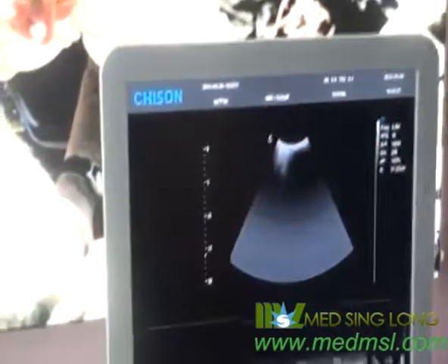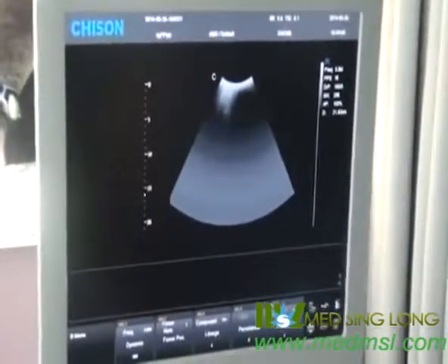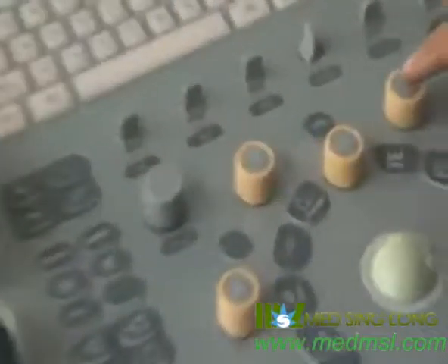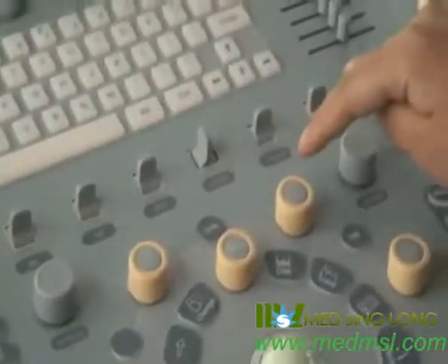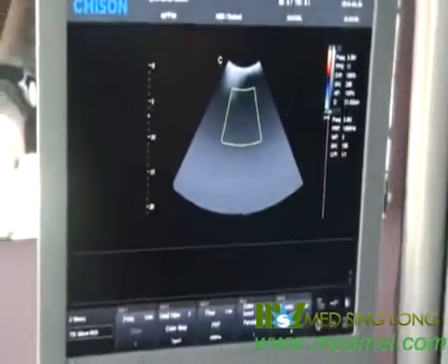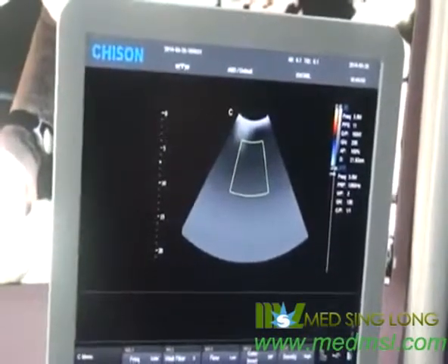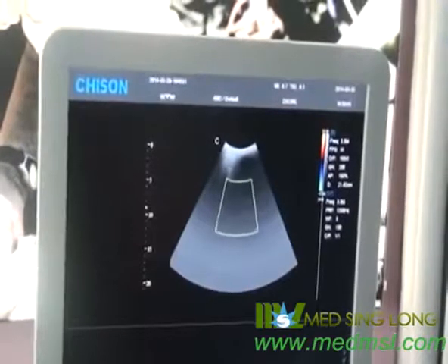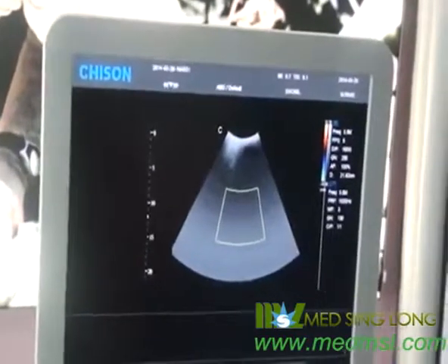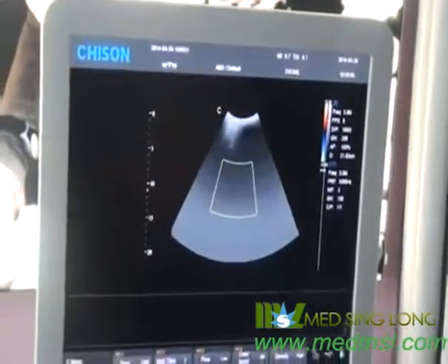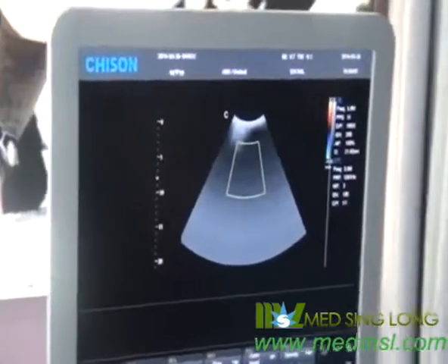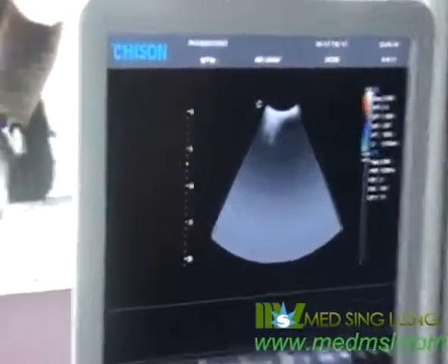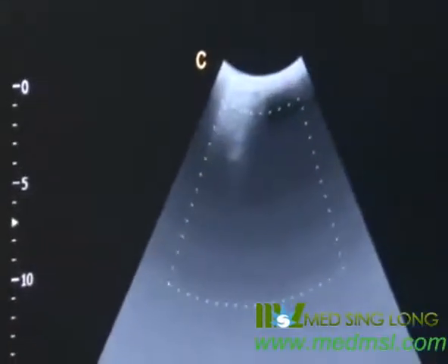Let's get into C mode. Just press the C knob and the color sample box will appear. We can move the trackball to change the position. Press the Enter key and move the trackball to change the size.